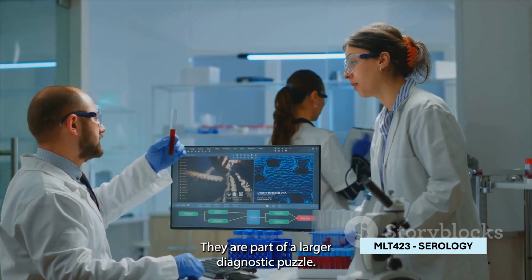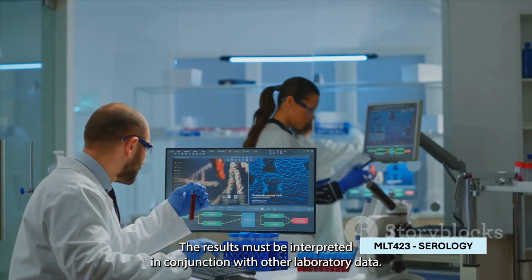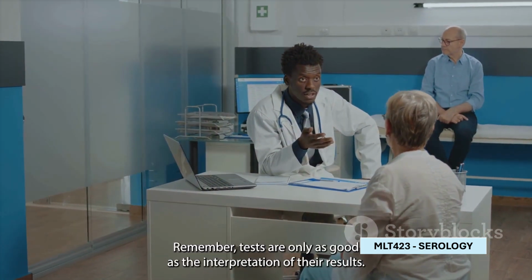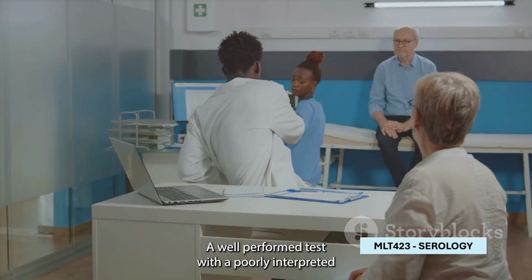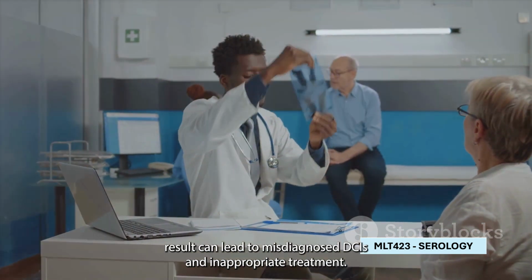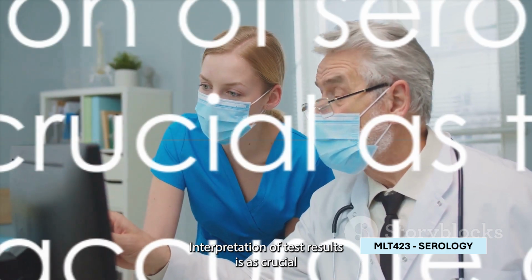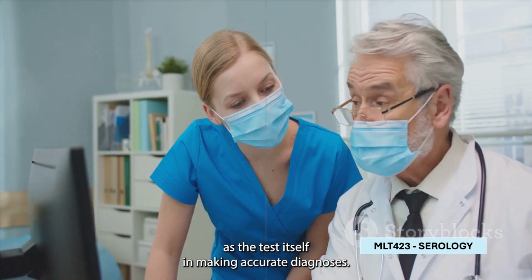Keep in mind that serology tests aren't standalone diagnostic tools. They are part of a larger diagnostic puzzle. The results must be interpreted in conjunction with other laboratory data, clinical findings, and patient history. Remember, tests are only as good as the interpretation of their results. A well-performed test with a poorly interpreted result can lead to misdiagnosis and inappropriate treatment. So it's crucial to interpret these results accurately and holistically. Interpretation of test results is as crucial as the test itself in making accurate diagnoses.